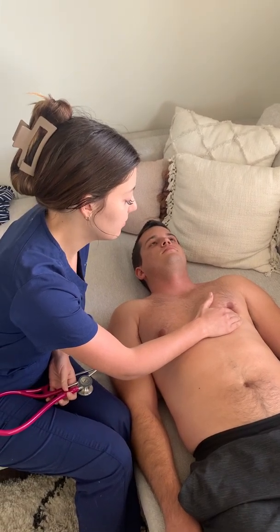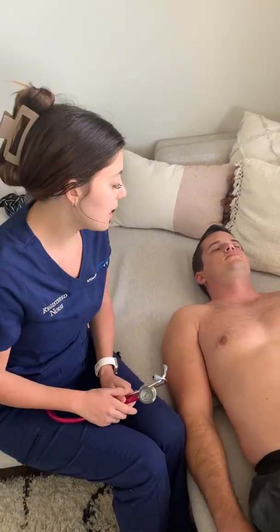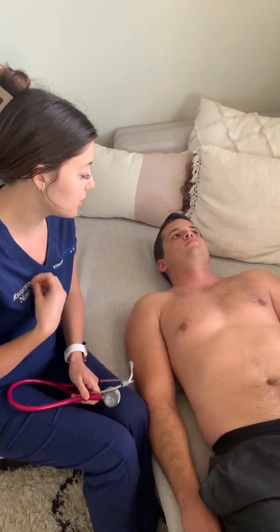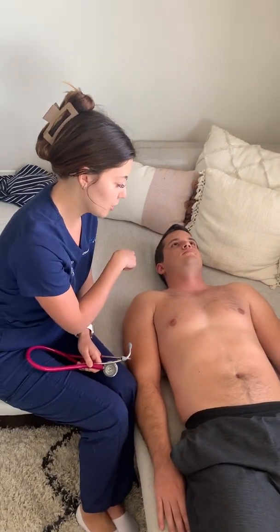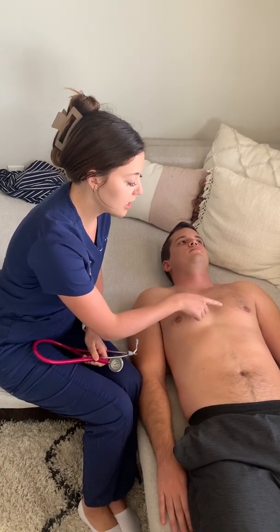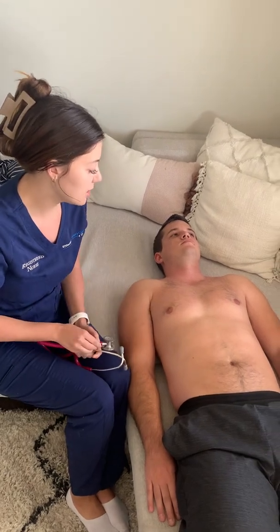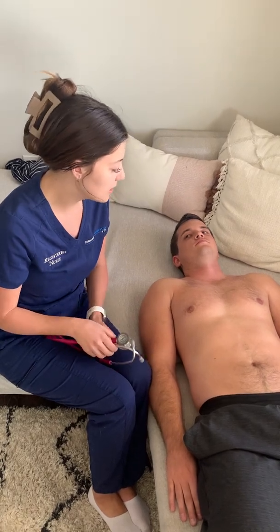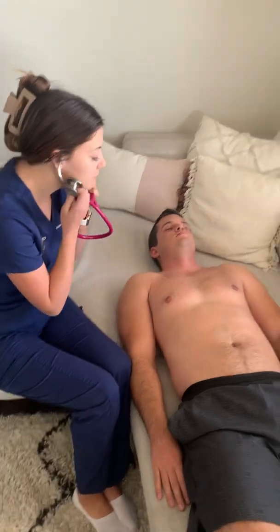Good. Okay. So I'm going to go ahead and listen to his heart, and I'm going to listen at 5 different areas. So the aortic valve at the second intercostal space on the right sternal border, the pulmonic valve on the left sternal border at the second intercostal space, Erb's point right below that, the tricuspid valve, and then the mitral valve. I'm going to listen first with my diaphragm, listening for S1, S2, and then any extra sounds like clicks or gallops. And then I'm going to listen with the bell of my stethoscope again to hear for any murmurs, okay?